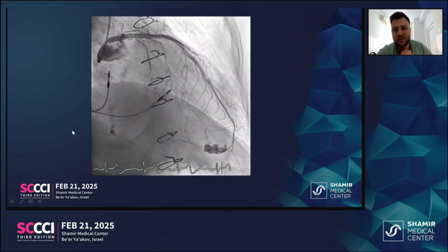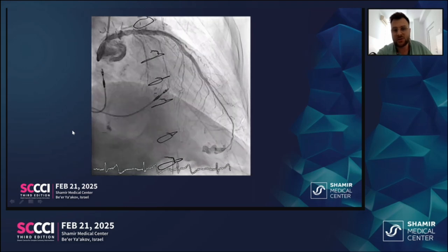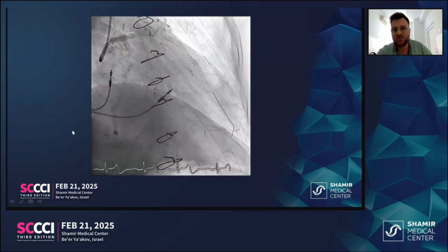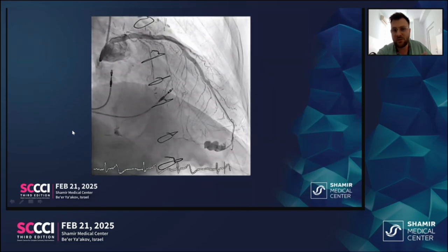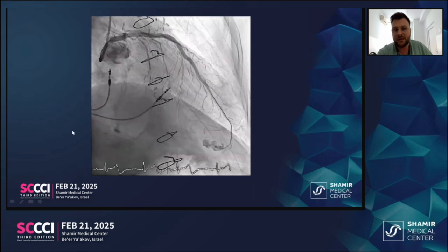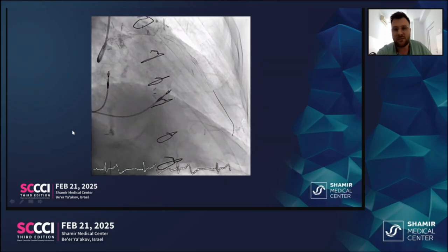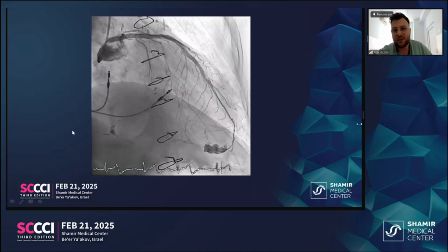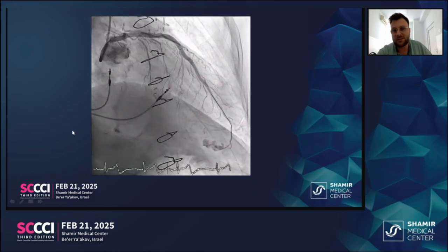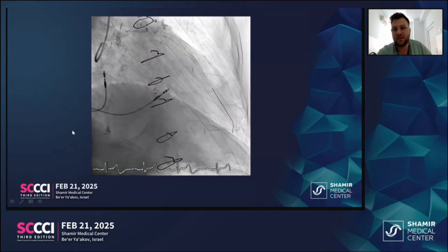I would say yes, because one, if it's the left ventricle, the pressure in the left ventricle is high, so this is actually what you can call a coronary-cameral fistula that will never close, because the spilling will always be at high pressure. Or if it's in a right-sided cavity like the right ventricle, veins, or right atrium, the pressure on the right side is lower, and that means, one, if you put a coil, it doesn't embolize into the brain, and second, if you leave it untreated, it may seal by itself.